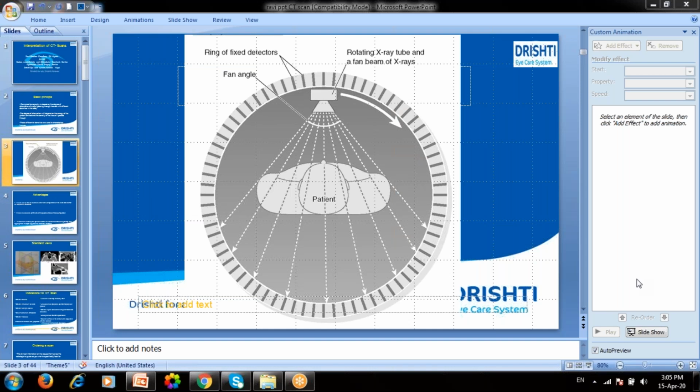Okay. So it has two kinds of contraindications, systemic and eye. In the eye, because it is radiation, it can cause cataract, and it can make your vitreous a little bit densified. And when it comes to the systemic one, it is totally contraindicated in pregnancy.